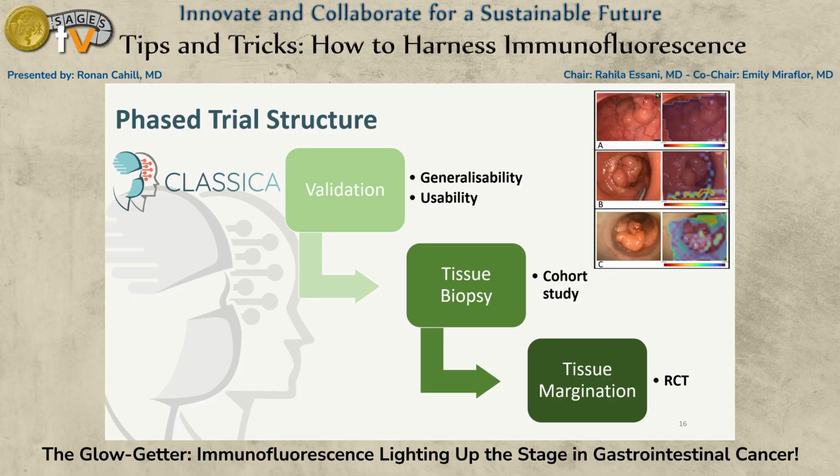But now we're going to run it in real time and look to see, can it either guide the biopsies or even obviate the biopsies by its accuracy of anomaly detection in the lesion, and finally end up with a small but significant randomized trial looking at the tissue margination, surgeon plus AI compared to surgeon alone.